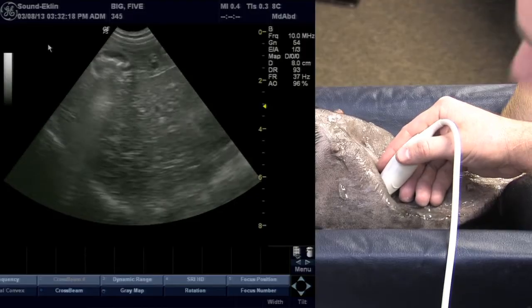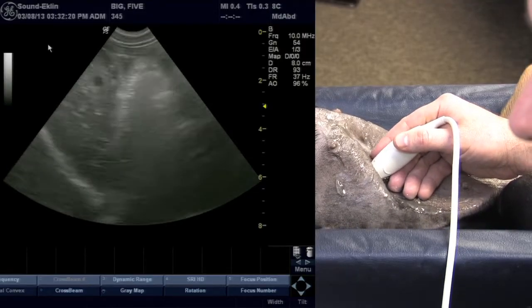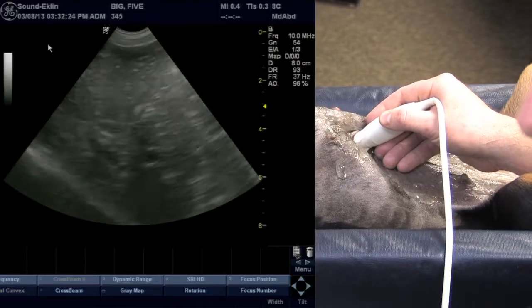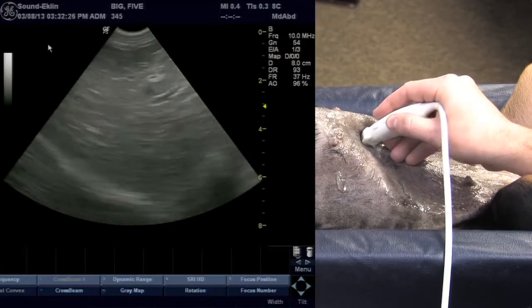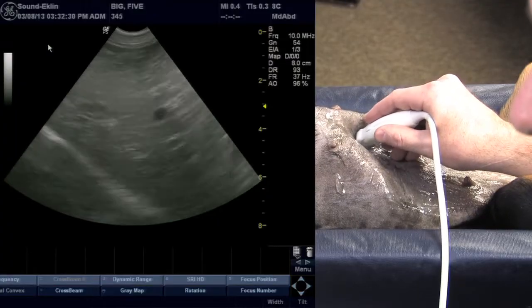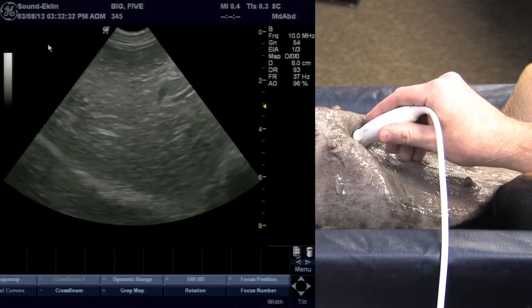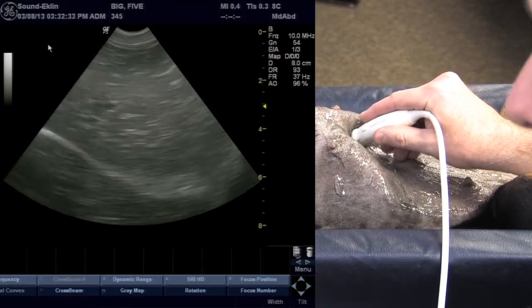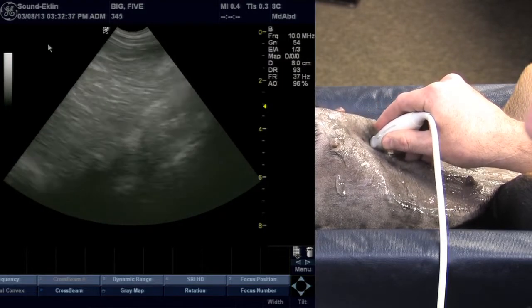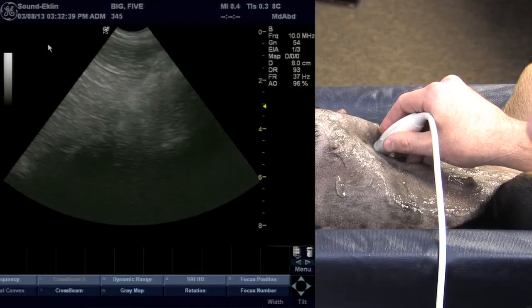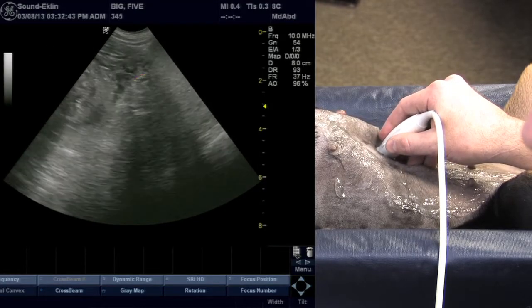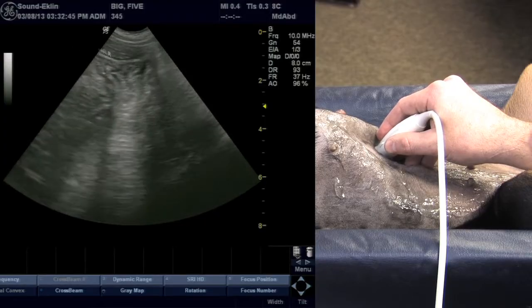At this point we're going to continue in a sagittal plane, go back up towards midline again picking up the gallbladder, and then sweep over towards the left side. Now my probe is along the left thoracic wall and I'm slightly tilting the probe to angle underneath the ribs to evaluate the left lateral liver lobes. We continue to do that until we either run out of liver — which is what we're doing here — or encounter stomach and spleen.